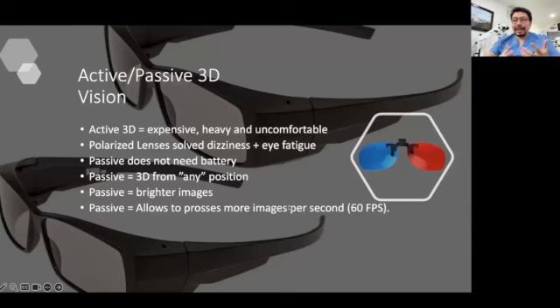So for what can we use the microscope? And here is an important thing. You can use the microscope for doing very, very precise treatment, like removing a broken file. For removing a broken file, you are going to need to go for the highest magnification, and you can do the preparation for receiving an indirect restoration, for example, which is not so precise most of the time.